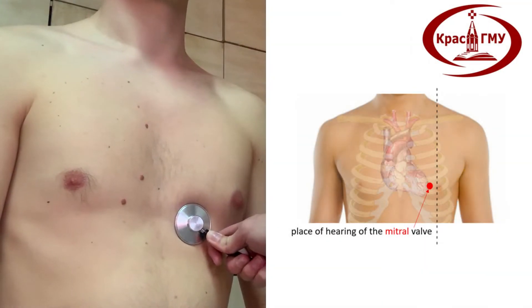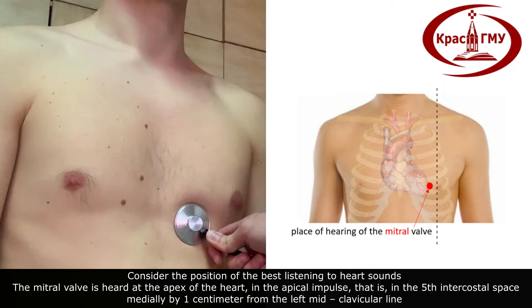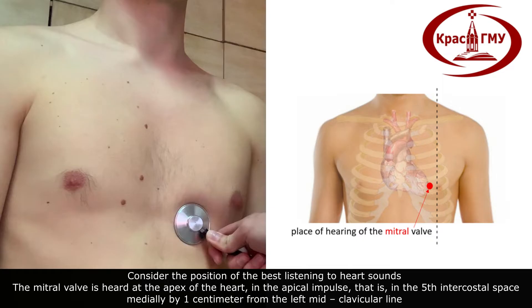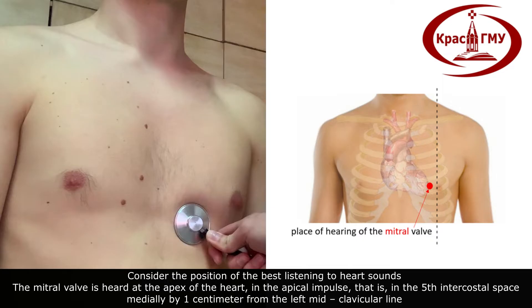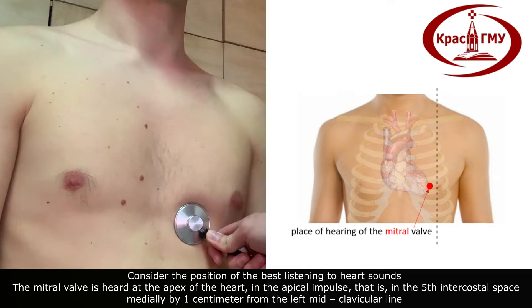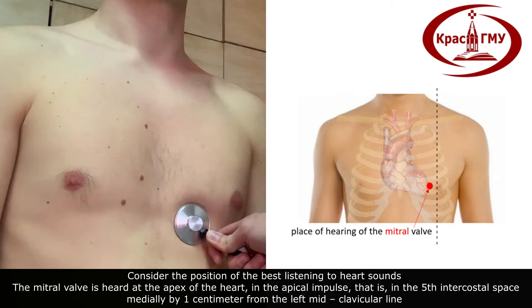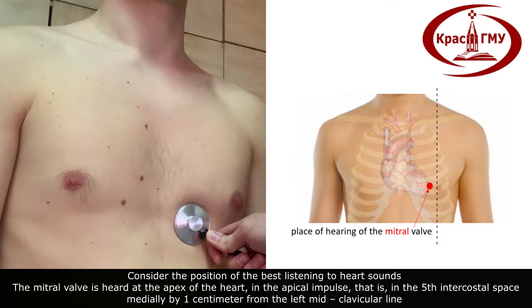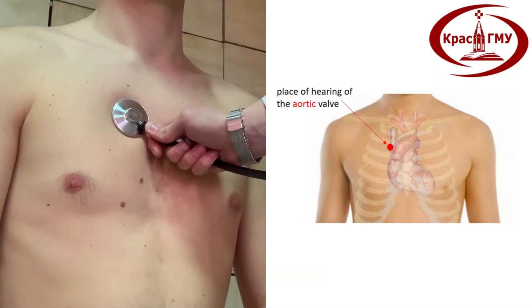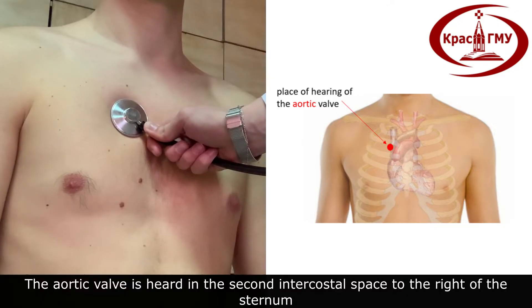Consider the position for best listening to heart sounds. The mitral valve is heard at the apex of the heart — the apical impulse — in the fifth intercostal space, medially by one centimeter from the left mid-clavicular line. The aortic valve is heard in the second intercostal space to the right of the sternum.